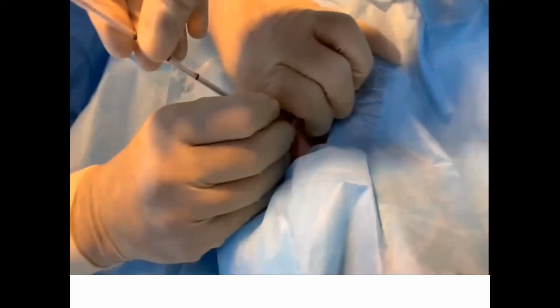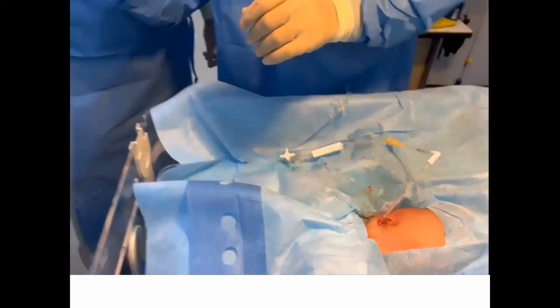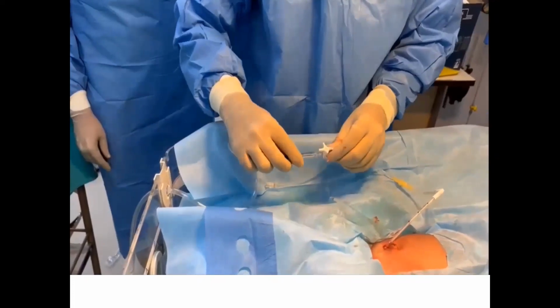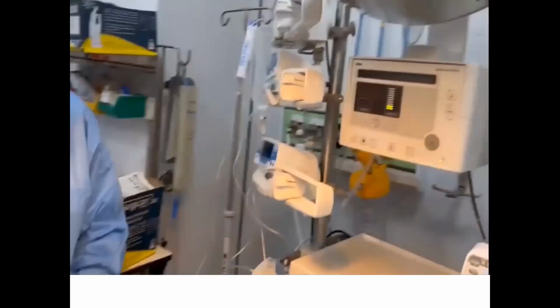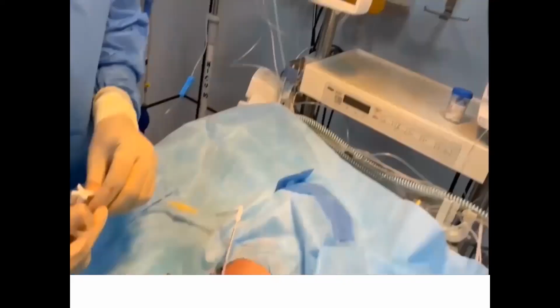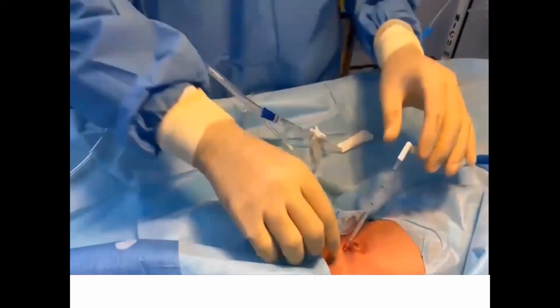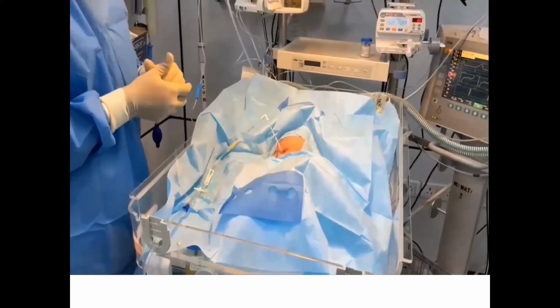The insertion of the PD catheter into the peritoneal cavity will be indicated by the giveaway of resistance and gush of dialysate fluid into the catheter. Then we have to connect the inflow and outflow circuit through the PD catheter. The outflow circuit is created using a triway, and one port of the triway is connected to the urobag through the 2 ml syringe. Then we attach the inflow circuit using a pediatric burette, and the end of the drip set is connected to the other port of the triway.